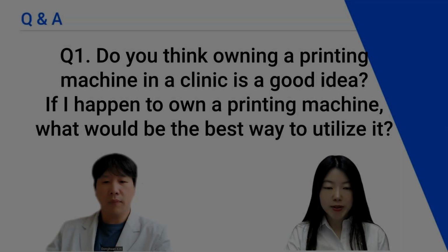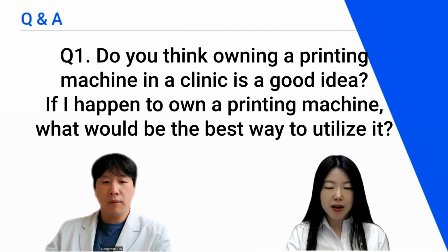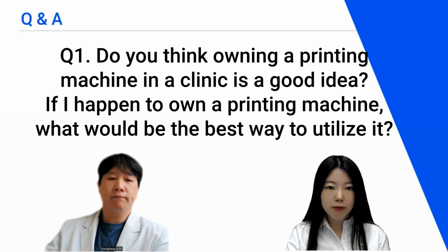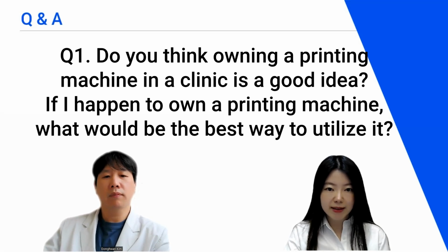So let's move on to Q&A sessions. So today we have 5 questions in total. So let's start with the first question. Question number 1. Do you think owning a printing machine in a clinic is a good idea? If I happen to own a printing machine, what would be the best way to utilize it?